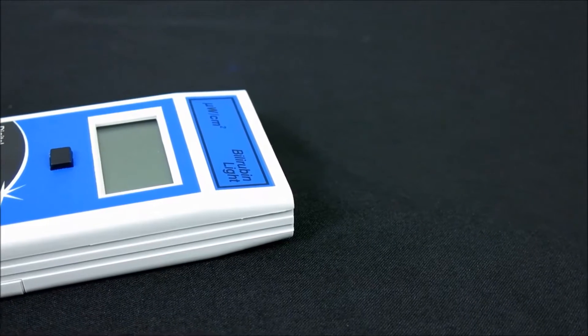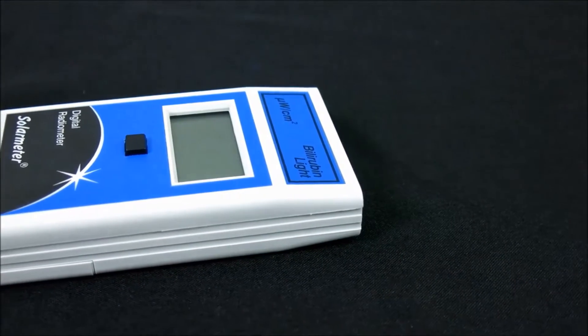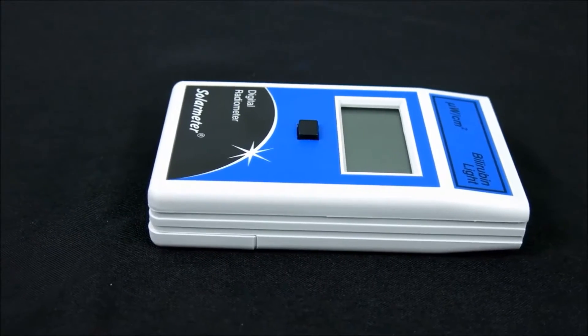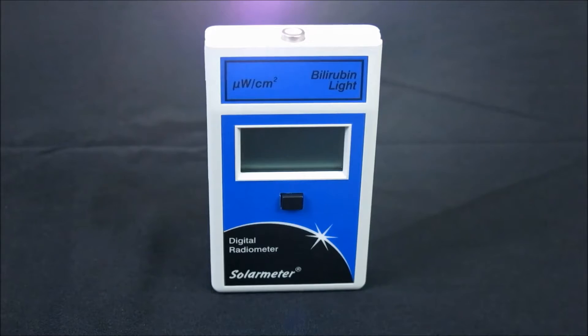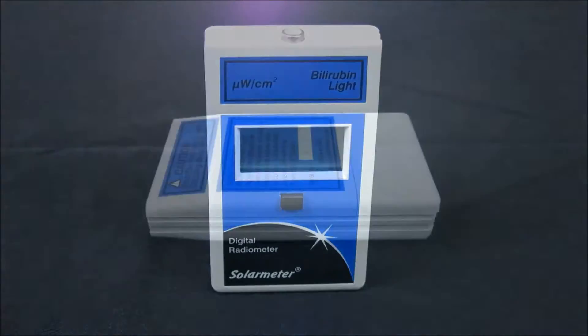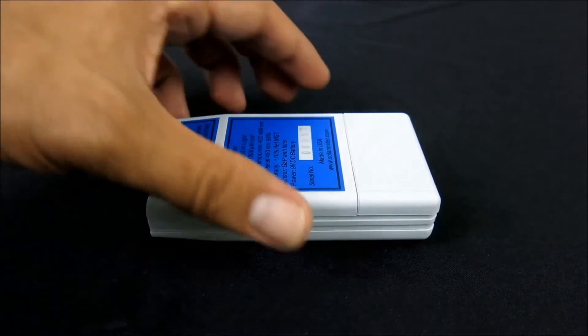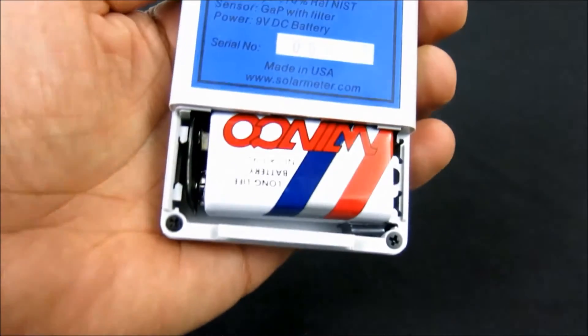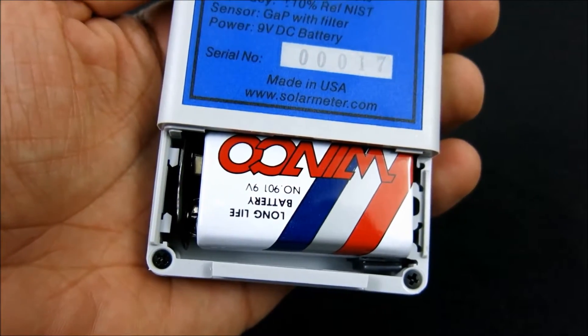This handheld model's rugged plastic case is palm-sized for effortless portability, measuring a compact 4.2 inches long by 2.4 inches wide by 0.9 inches deep and weighing only 4.5 ounces, including the 9-volt battery. The battery works down to 6.5 volts before requiring replacement, so it should last approximately two years under typical service load.